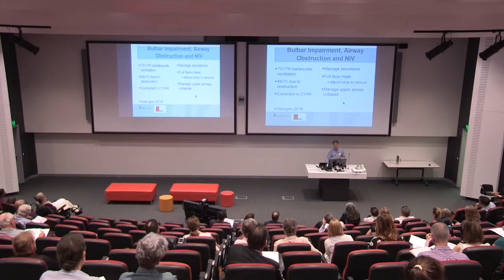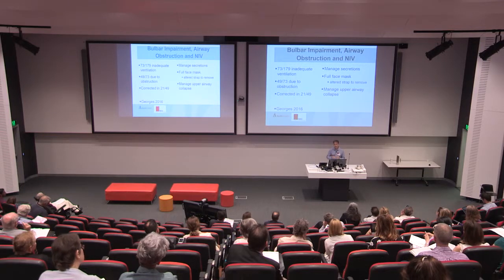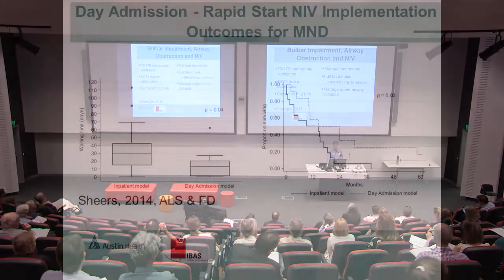One of our other PhD students who's just finished, Leon Hannon, ran a study looking at the benefits of making all of those adjustments and showed that you could reduce these events overnight, and that also meant that people were able to use the ventilation more effectively and for more prolonged periods during the night time.